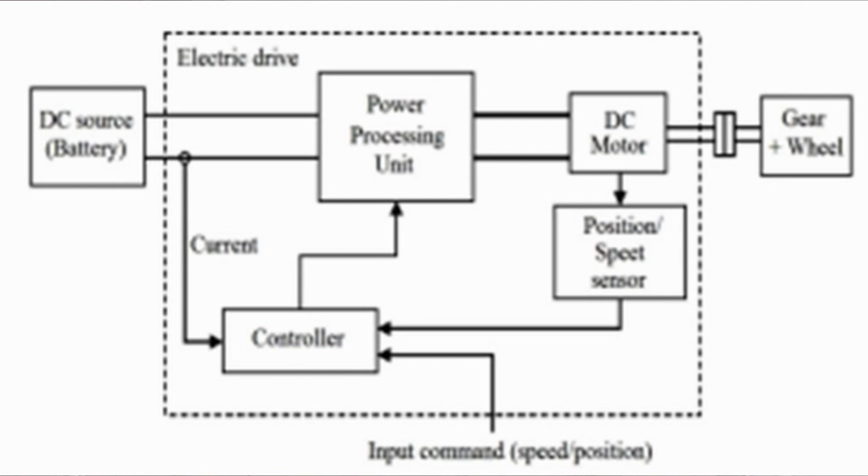Here shows how the input from the sensors can output signals to the processing unit to calculate how much power the wheels need and where to go. The block diagram is here to help us understand how the wheelchair functions. An infrared receiver and emitter is also required for the nurse. Also, the patient will have an infrared emitter and receiver to call the wheelchair to the nurse.